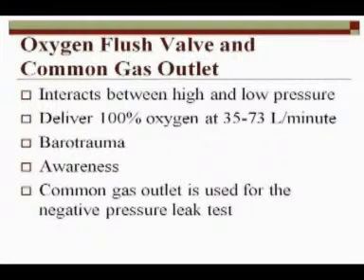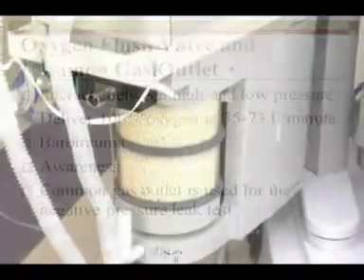Barotrauma can be caused if the valve is flushed during the inspiration phase of positive pressure ventilation or if the valve sticks in the fully open position. Using the valve can cause awareness since the oxygen flow dilutes the anesthetic and does not flow through the vaporizer.